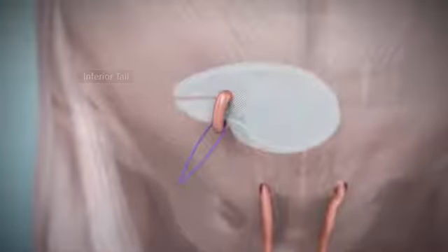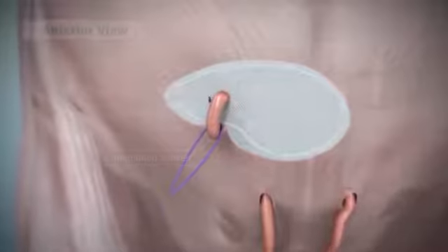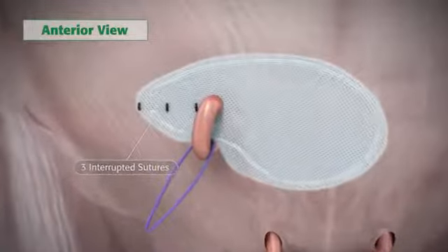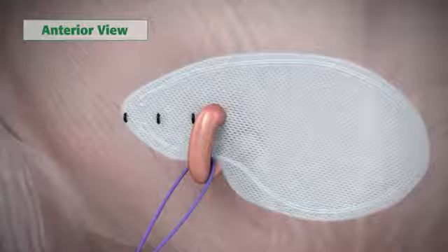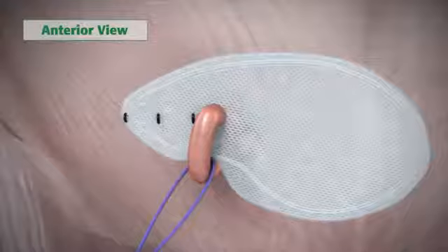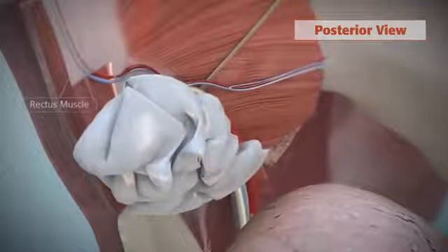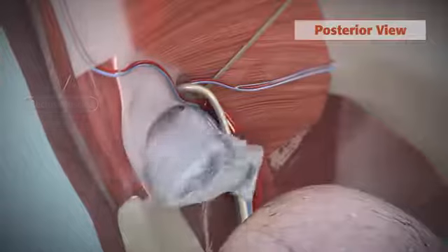Place the inferior tail of the Polysoft hernia patch under the spermatic cord, so that the tails are pointing lateral. Place 3 non-absorbable interrupted sutures into the hernia patch to join the prosthetic tails together. Please note, this technique is tension-free and no sutures are placed into the tissues to fixate the Polysoft hernia patch. Remove the sterile gauze from the operating site and return to the scrub nurse.